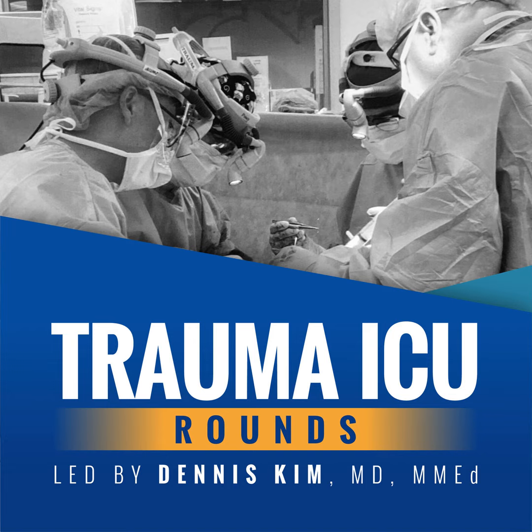And here we're going to discuss the considerations that we want to address prior to actual removal of the artificial airway. So at the beginning of rounds, we discussed the basic approach to figuring out if our patients can be extubated. And the first question we asked was, can my patient breathe on their own without the ventilator? And we went through the readiness assessment criteria as well as weaning criteria that may potentially predict success of the SBT and how we perform an SBT. The second major question was, can my patient breathe without the endotracheal tube? And so for the remainder of rounds, we're going to focus in on this question.